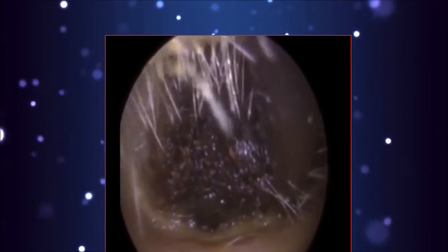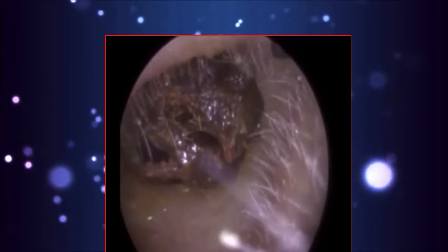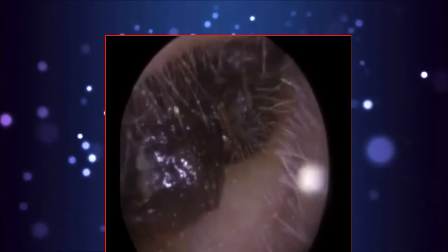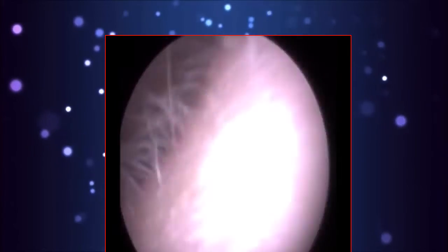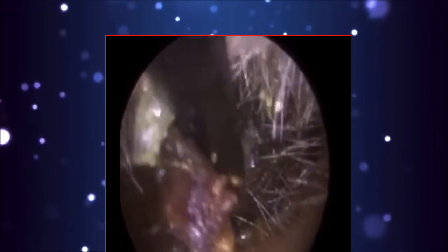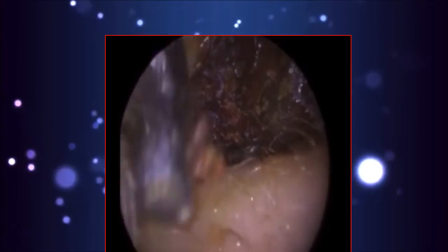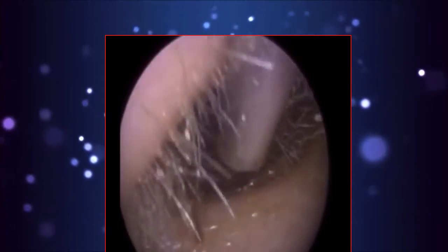So I've decided to go in with an ear hook. The patient was finding this a bit uncomfortable, and it was just purely because how lodged this wax was and how hard it was. And you can see I wasn't making any contact with the canal wall, but he was finding it slightly uncomfortable. He was happy for me to continue. The alternative was just to carry on vacuuming, and I don't think that was going to really remove this wax.